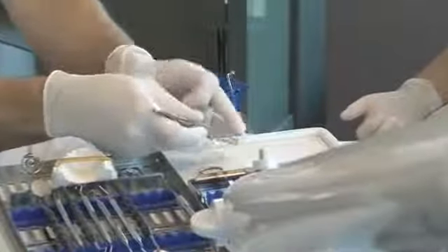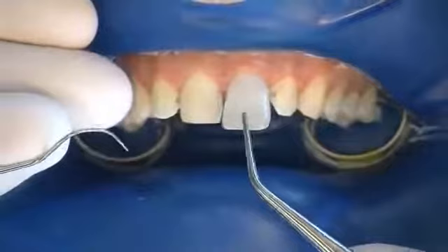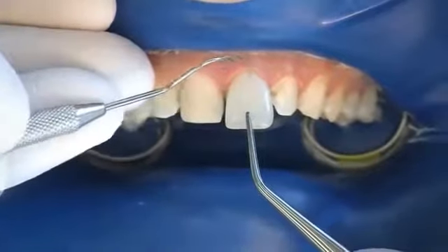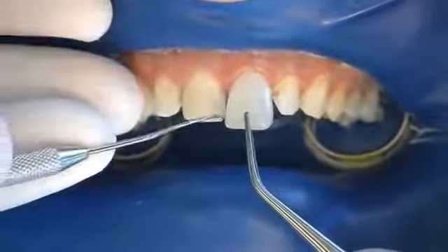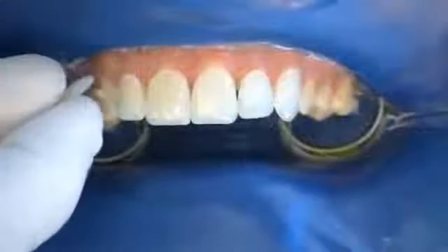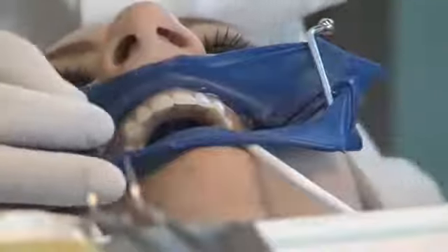Shapes are corrected if necessary using a low-rpm disc operated in a dry oral environment; the Componeer holder provides a perfect hold for this procedure. Corrections of shape for cervical contour and incisal length can be checked directly on the tooth. The corrected Componeers can also be placed on the teeth using a small portion of composite.